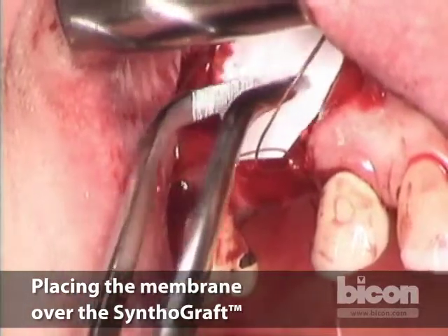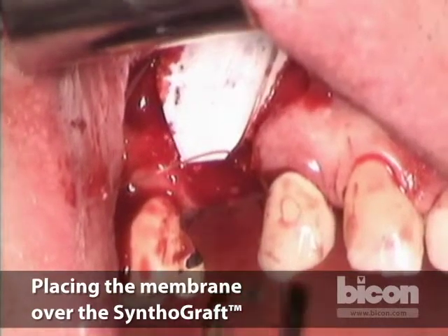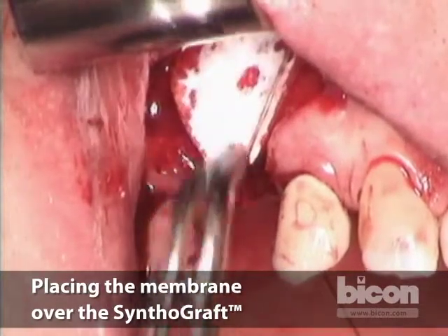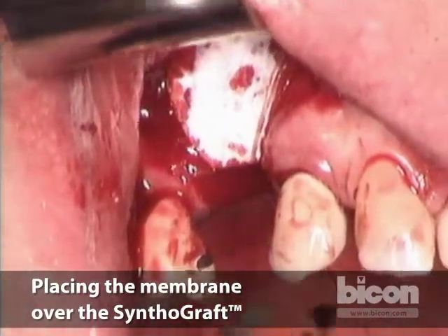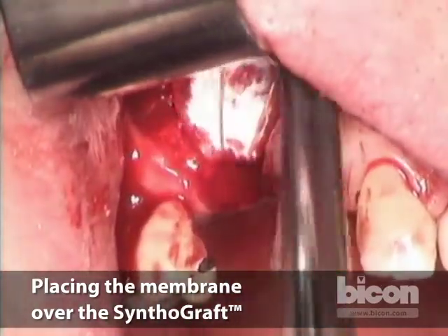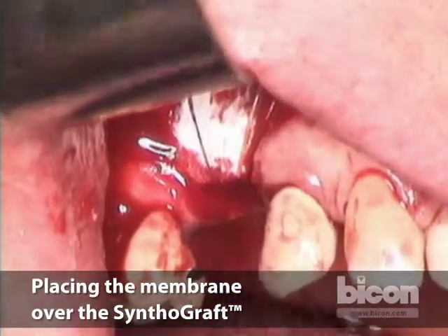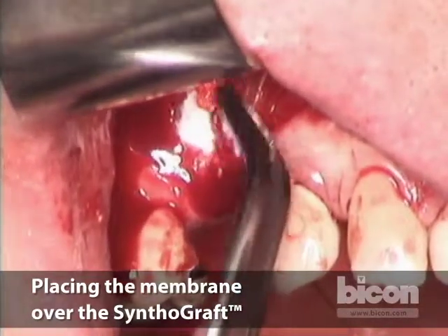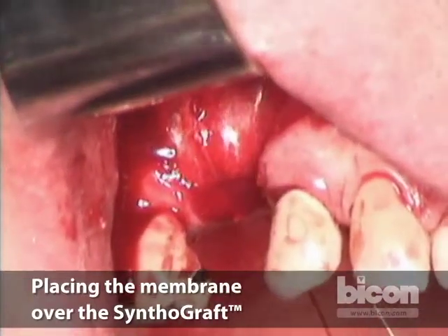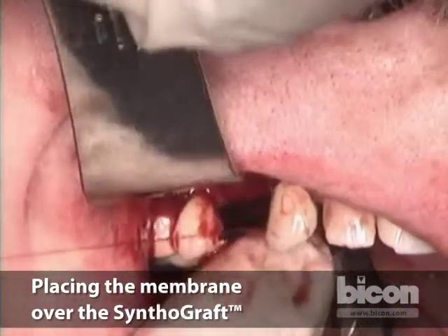Okay. And this is where you have to really move swiftly, as you don't have much leeway in terms of the graft kind of moving on you. There is a little bit of bleeding, especially when you haven't used any epinephrine. So we want to just drape it over. This is the suture. Goes right over this membrane. We hold it down. Want to make sure it doesn't fold. Great. And we pull that down. We pull that down as well. Then we still have a little tail.